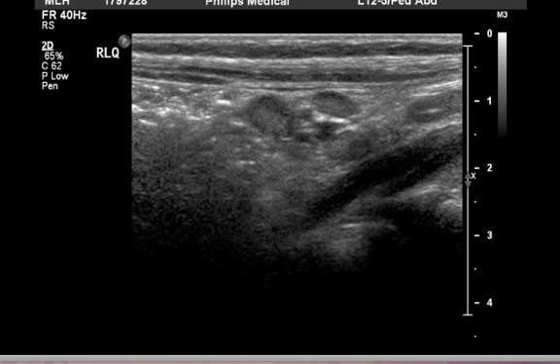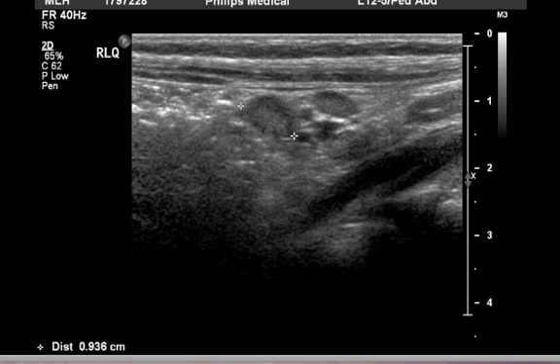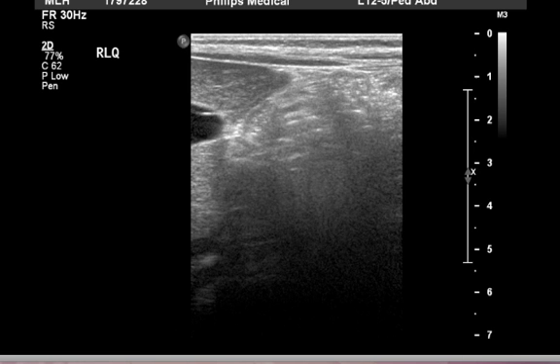We used to do barium enemas and contrast studies to determine whether or not that was present. We have found that ultrasound works quite well for that. This is an ultrasound, and again, it illustrates how hard it is to know what you're looking at unless you're told.